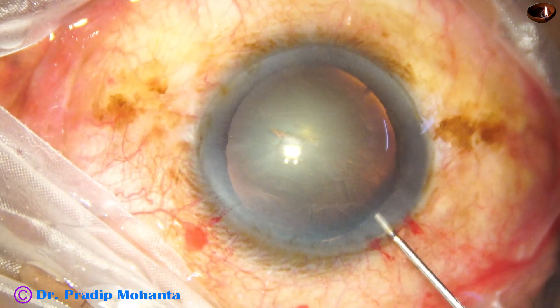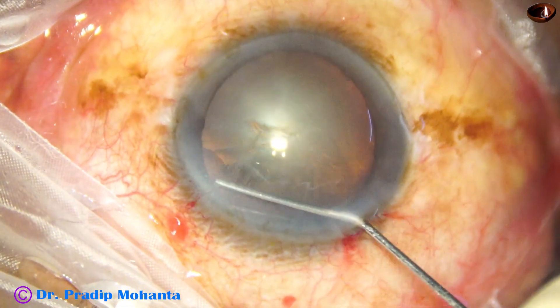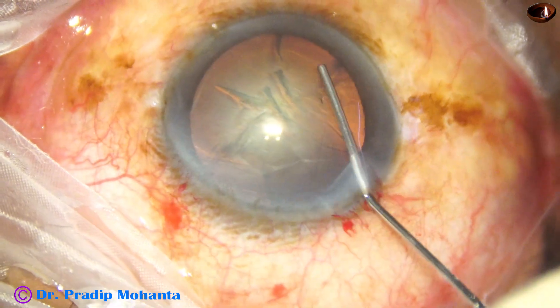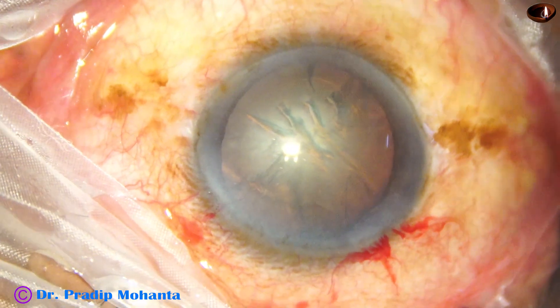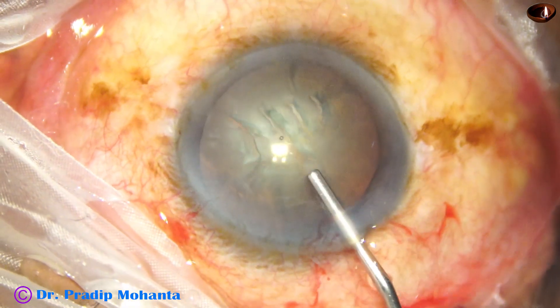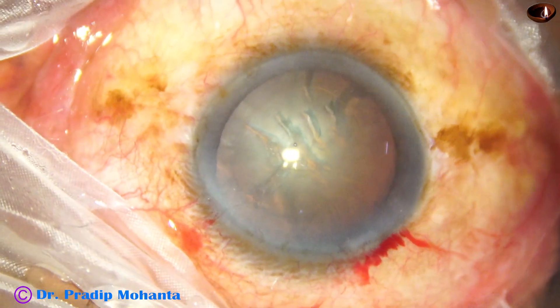Now hydrodissection is done with BSS using a 27-gauge cannula, and the nucleus is rotated. I have already planned to use a capsular tension ring.